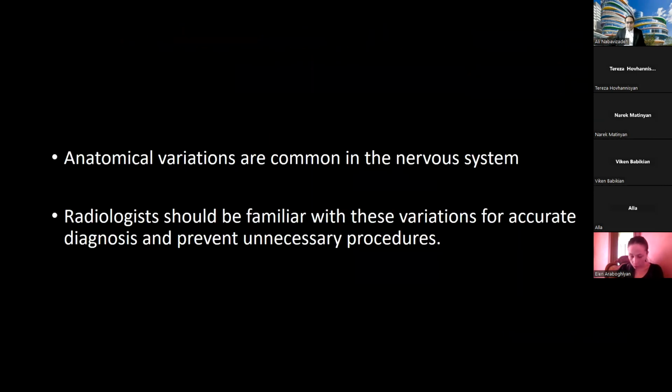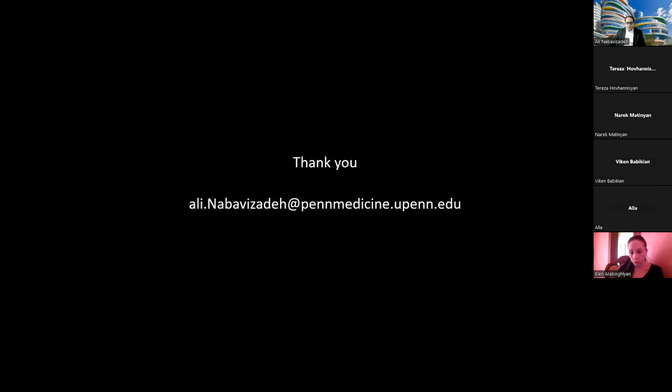And so this is my last slide, and I want to emphasize that anatomical variations are very common in central nervous system, and we as radiologists should be familiar with these variations to make accurate diagnosis and prevent unnecessary procedures.